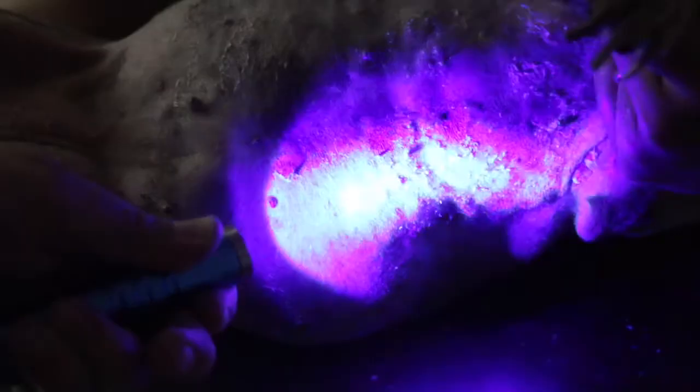In this second example, you can see that the vet is trying to cover many areas of the dog with the UV light and moving very quickly. This is one thing we should try our best to handle, as it is not easy to focus on the spots and areas the vet wants to cover. For the camera, we have to move it around quickly and constantly try to focus by tapping on the screen. You will see that the vet covers many areas and moves the UV torchlight around while the cameraman tries to chase after it. Though we managed to capture certain aspects of the fluorescent areas, it wasn't done very well.